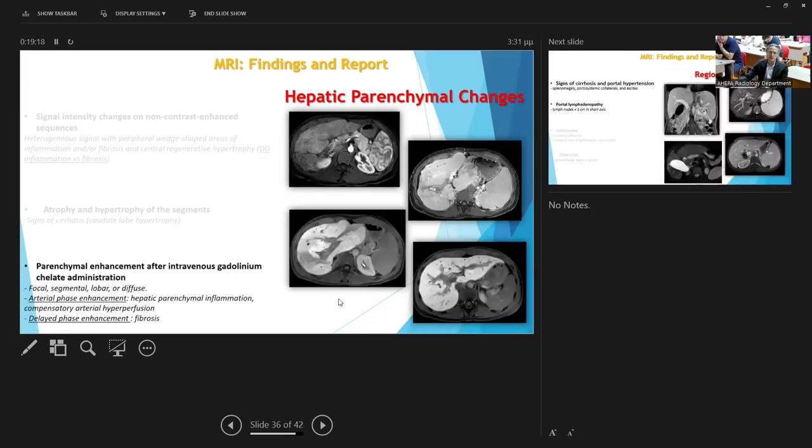Finally, when we use the contrast agent, we should look at the area of altered enhancement in line with the phlogistic phenomenon. We should recognize the irregular enhancement of the different segments, retraction of capsule, and hypofunctioning area when we use the hepatobiliary contrast agent. In this case, we could appreciate the delayed enhancement of the fibrotic tissue along all the biliary tree.